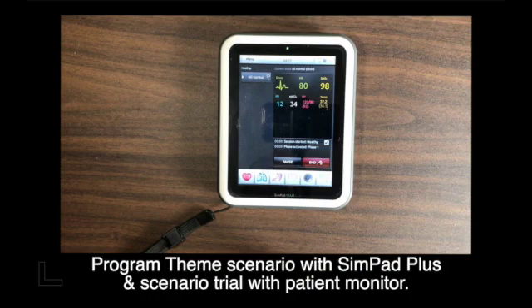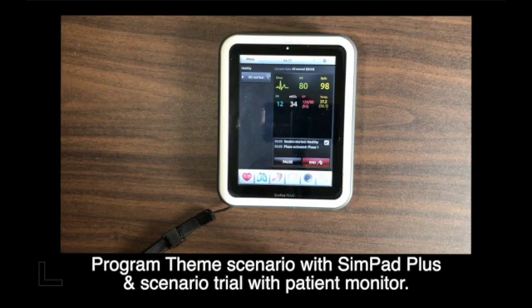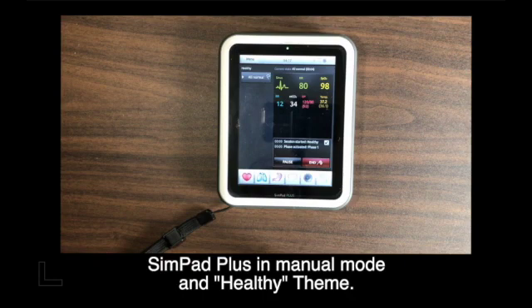Hi, this is Chung. Let us look into designing a theme scenario with SimPad Plus and scenario trial with SimPad Plus and patient monitor. Please note that my videos are not a replacement of the Mannequin User Guide. These videos are to share what I know and how I apply these devices into healthcare simulation training. Let us get into the SimPad Plus.